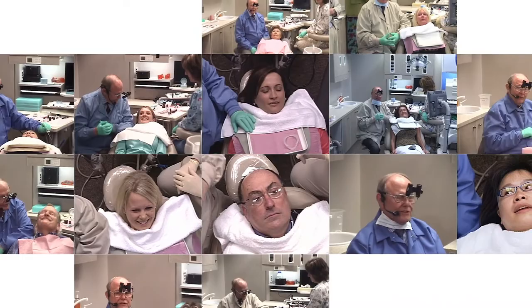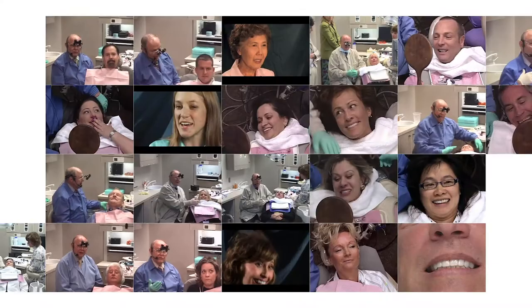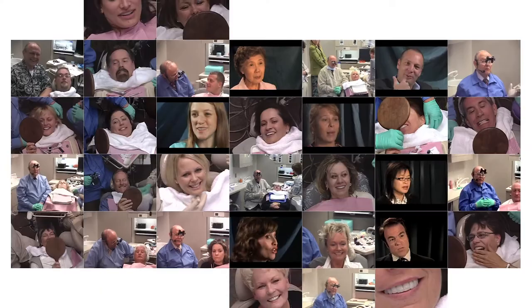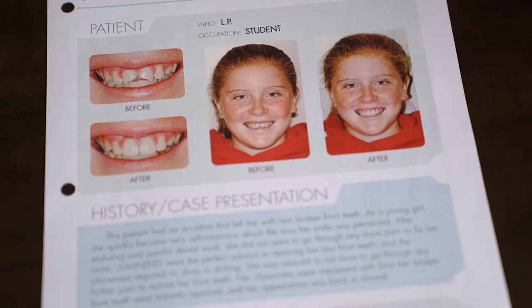California. Now we're going to place lumineers on our patient today. And now we're not treating teeth anymore — we're treating smiles. Isn't that beautiful? Let's look at the transformation from where we started and where we are. Our patient today is an example of that.